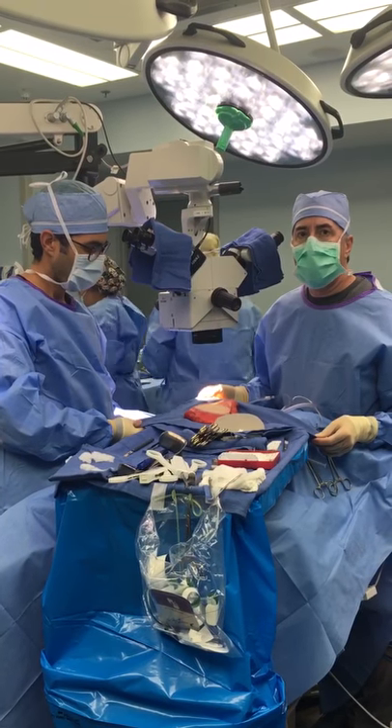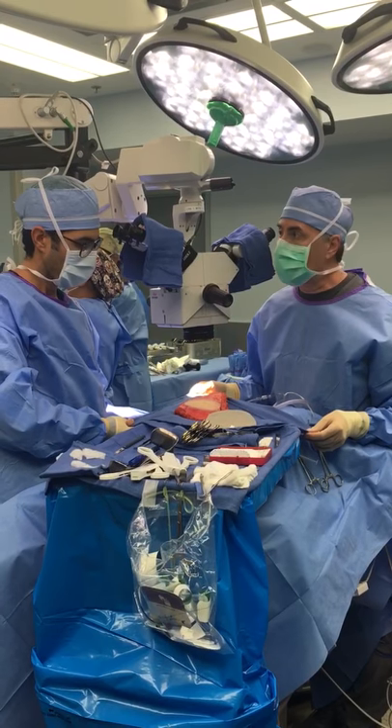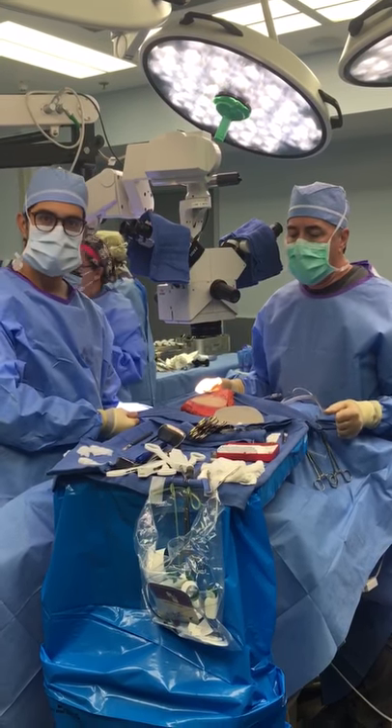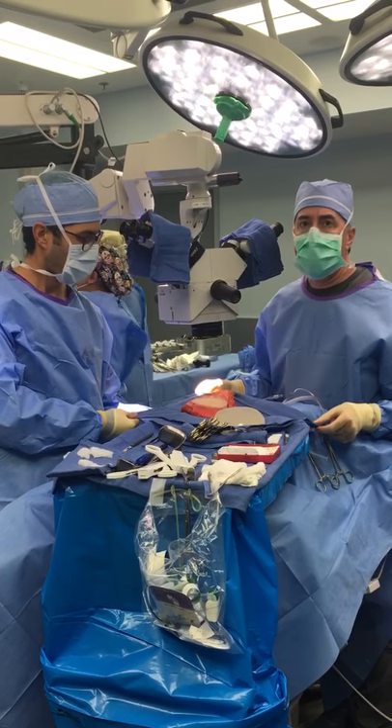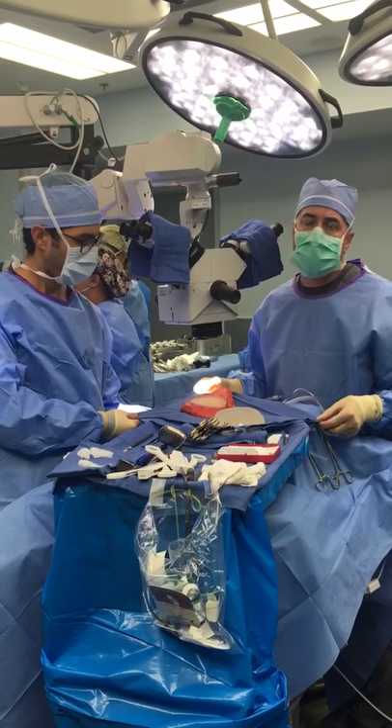So today here at PRMA, we are doing a conversion from an implant reconstruction — Dr. Garza and myself. This patient had an implant reconstruction that was under the pec muscle and had dermal matrix. She was very uncomfortable and had a grade 4 contracture.